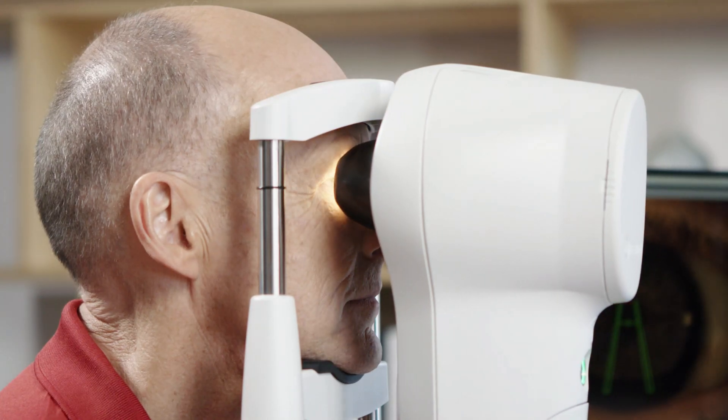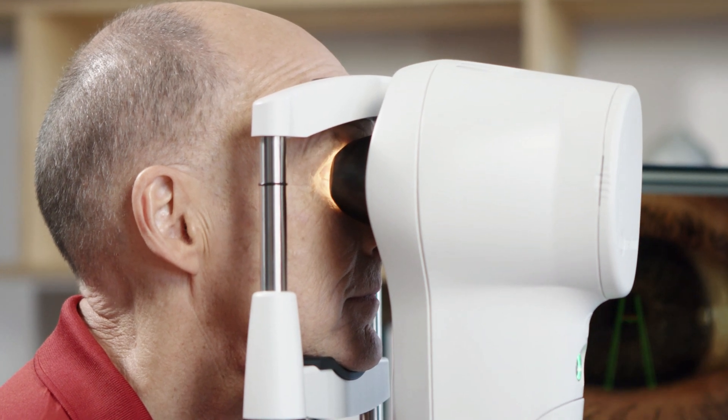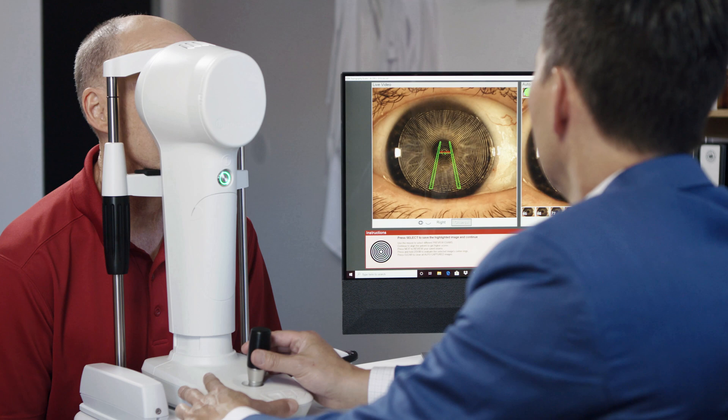Follow the same steps if you are taking a capture of the left eye, except you will get the patient to turn their head to the right this time. Now that you have the patient properly aligned, you are ready to take a capture.